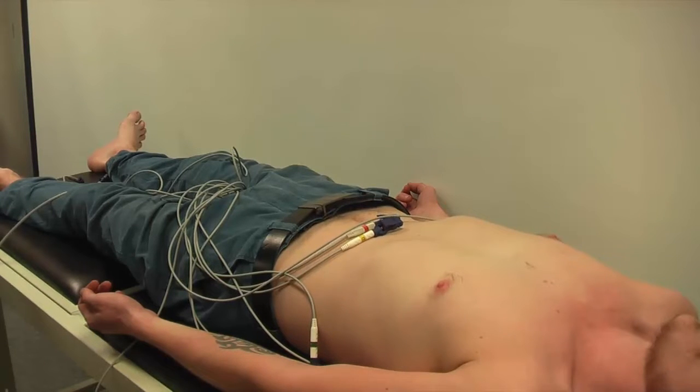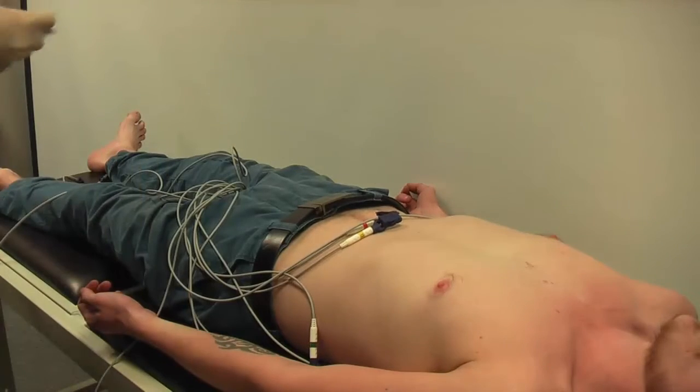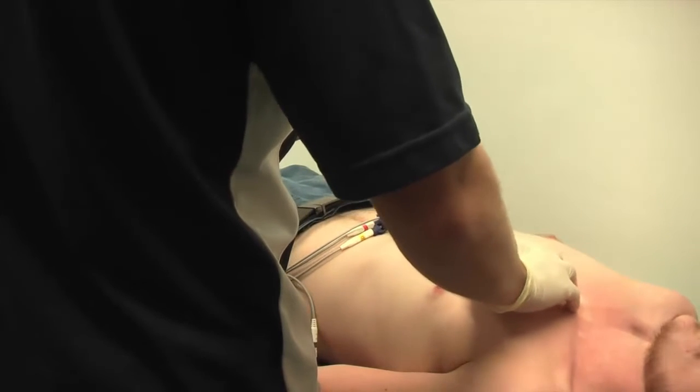The electrodes that we're going to place on the patient now have been in the practitioner's pocket for about a minute, so they've warmed up and should be fairly close to ambient temperature.